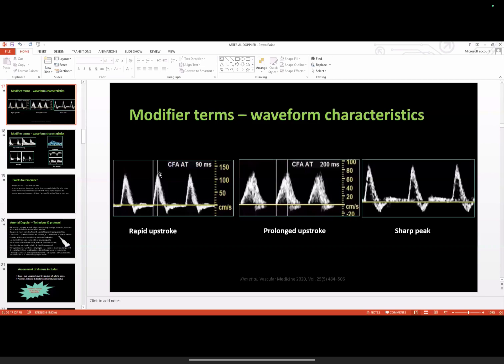Thank you, sir. And this is the deceleration, and this is the diastolic flow. This indicates the downstream arterial system. When there is low resistance, there is more diastolic flow. So every spectrum indicates, and the acceleration time practically indicates, the proximal tree status. Right? Yeah, thank you, sir.